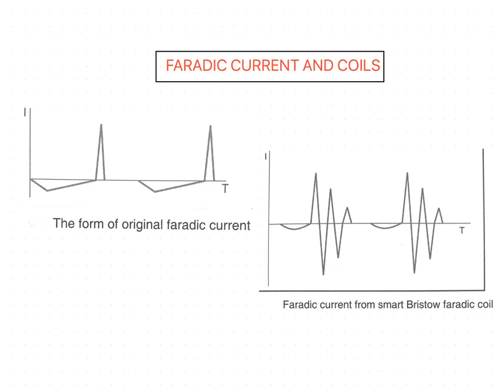Dear students, welcome back. In this session, we are going to discuss the Faradic current, how the Faradic current is produced using some apparatus, and in the apparatus, what coils are used to produce Faradic current. Okay, so now what do you mean by Faradic current? I have already mentioned it in the therapeutic currents.